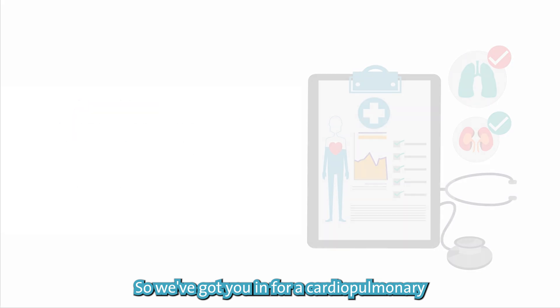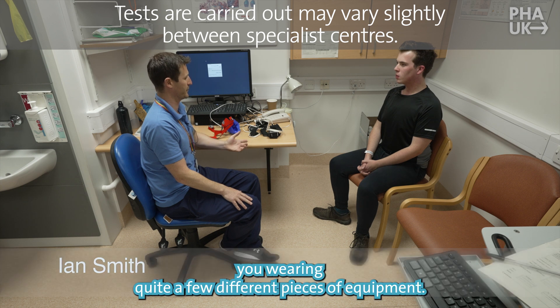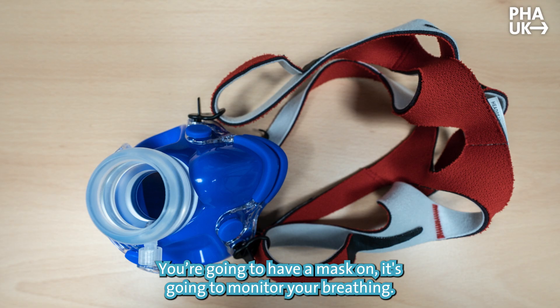We've got here for a cardiopulmonary exercise test, which is a maximal exercise test on a bike. It involves you wearing quite a few different pieces of equipment. We're going to pop a 12-lead ECG on, that's going to monitor your heart rate and rhythm throughout the test. You'll have a mask on, that's going to monitor your breathing.